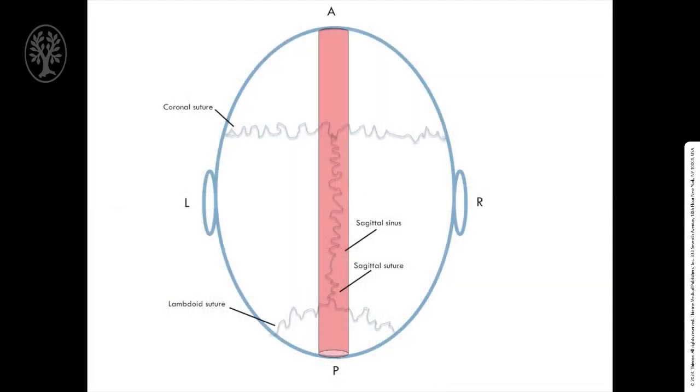The patient was positioned supine on the operating table. The head was held in a straight AP position with Mayfield pins. We used a zigzag incision in the coronal plane to allow for optimal cosmesis of her scar. The bone flap was graded to incorporate the coronal suture and cross the sagittal sinus. This is to allow for retraction of the sinus for better visualization of the anterior corpus callosum.